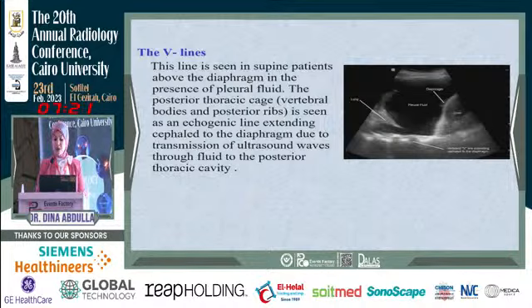We can see a chest wall hematoma. Here is a rib fracture with displacement and mild overriding, and an overlying heterogeneously echogenic hematoma can be seen. Also, surgical emphysema. As we discussed before, surgical emphysema appears as E-line artifact. We can see echogenic linear artifact superficial to the pleural line, which represents air under the skin or air within the chest wall.